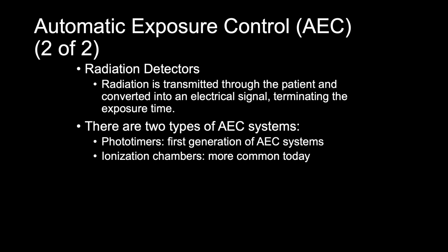All AEC devices work by the same principle: radiation is transmitted through the patient and converted into an electrical signal, terminating the exposure time. This occurs when a predetermined amount of radiation has been detected, as indicated by the level of the electrical signal that has been produced.